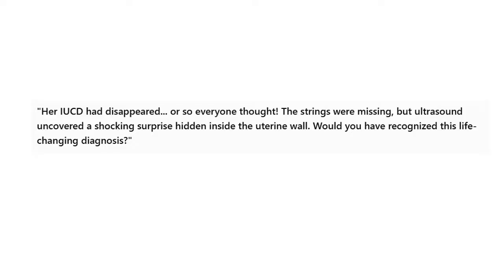Would you have recognized this life-changing diagnosis if you were doing the sonar yourself? Those are the things that you have to ask yourself. Diagnosis must transform. Diagnosis must assist, must help, must localize. So a patient in your hands must get the best experience, and you must give the correct diagnosis for correct management. If you rush things, you are going to say that the IUCD is in situ or in the normal position, and then you can miss the diagnosis.